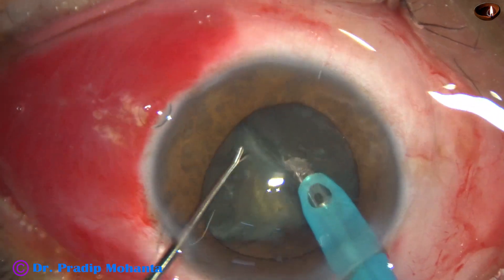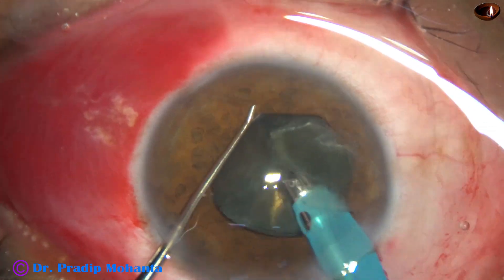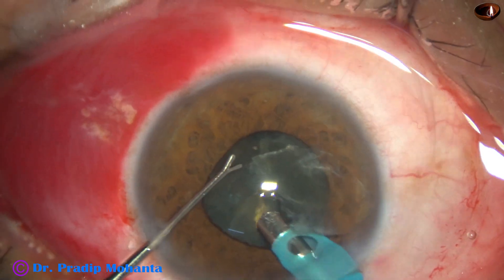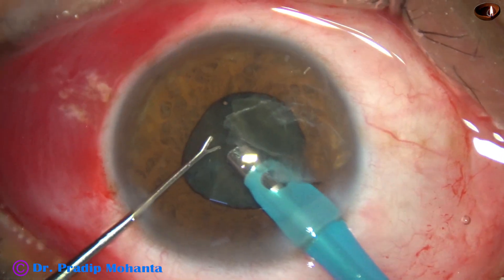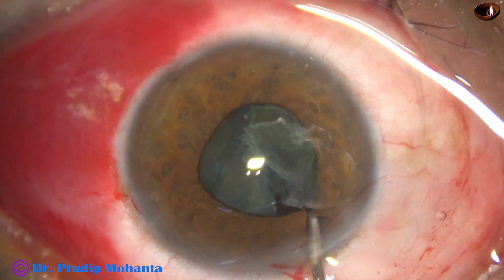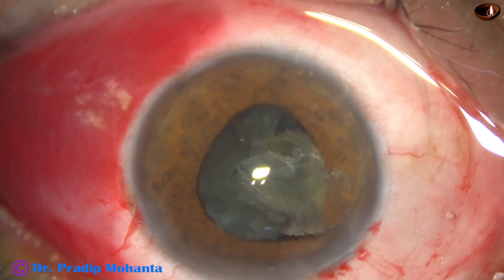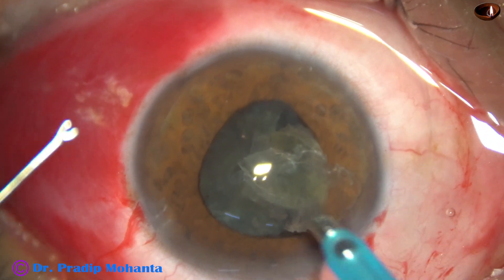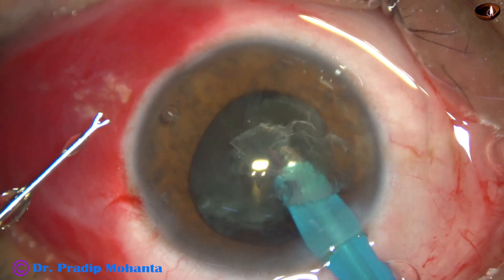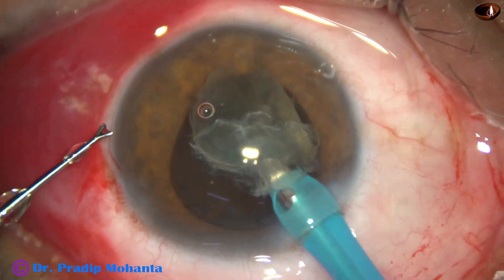As long as the anterior chamber is deep the iris is manageable, but now the chamber has become shallow and I need to come out. Inject visco again, make the anterior chamber deep, and this time I go only with the handpiece and emulsify the nuclear piece.